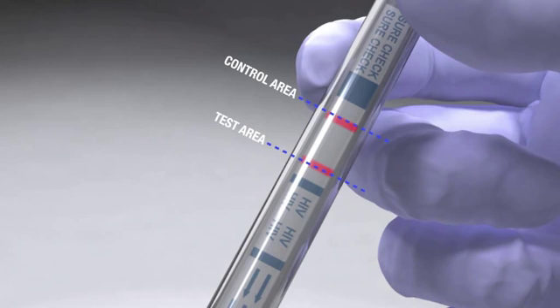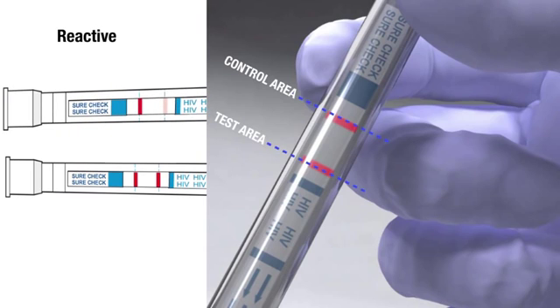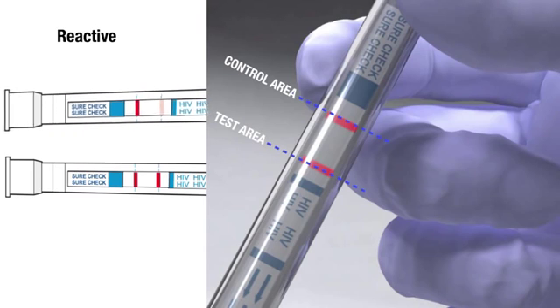Two pink-purple lines — one in the test area and one in the control area — indicate a reactive test result. The line in the test area may look different from the line in the control area. Intensities of the test and control lines may vary. A test result with visible lines in both test and control areas, regardless of intensity, is considered reactive.